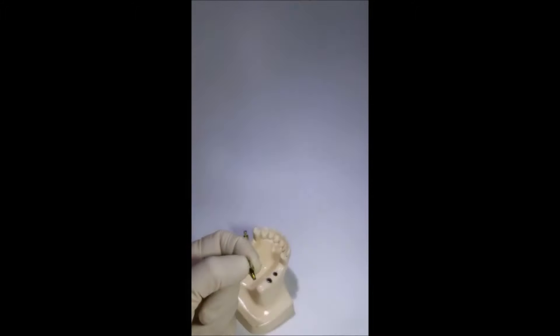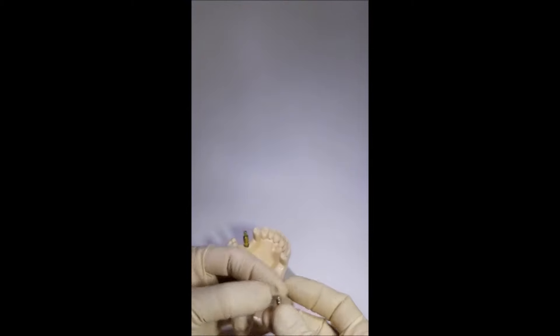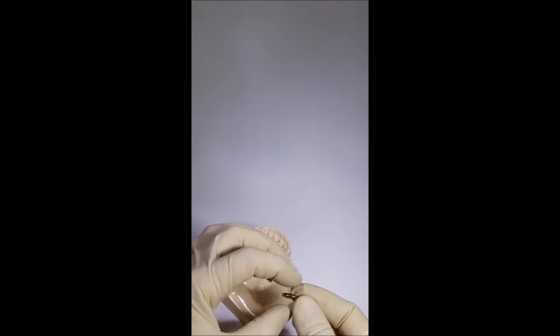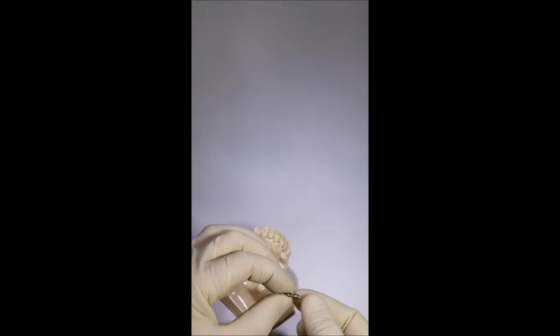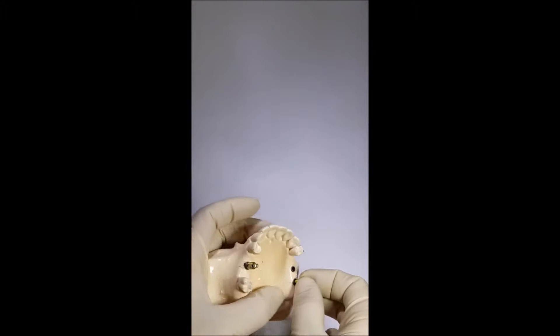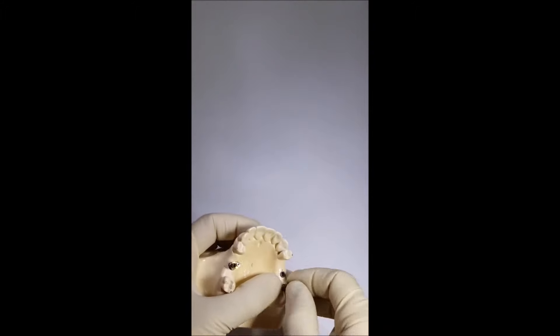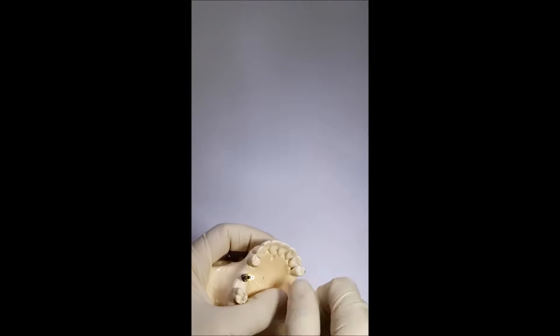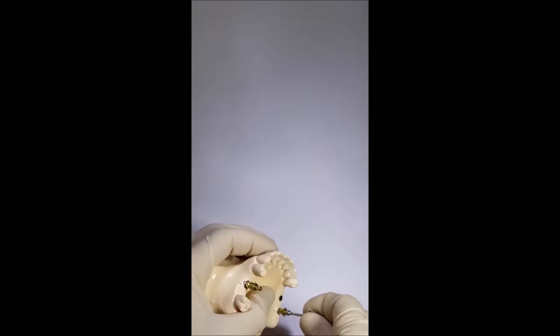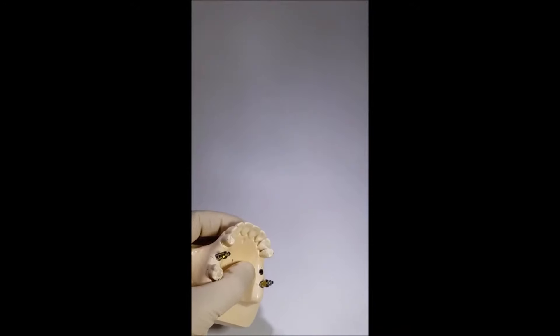The closed tray is used to make an impression with the closed tray impression technique. It has a body with smooth forms, a symmetrical surface, and a small profile, with a screw of similar form. The transfer is installed in the implant, fastened with fingers, and fixed by a hex driver. Then we put an impression tray with impression material and wait until the material is hardened.